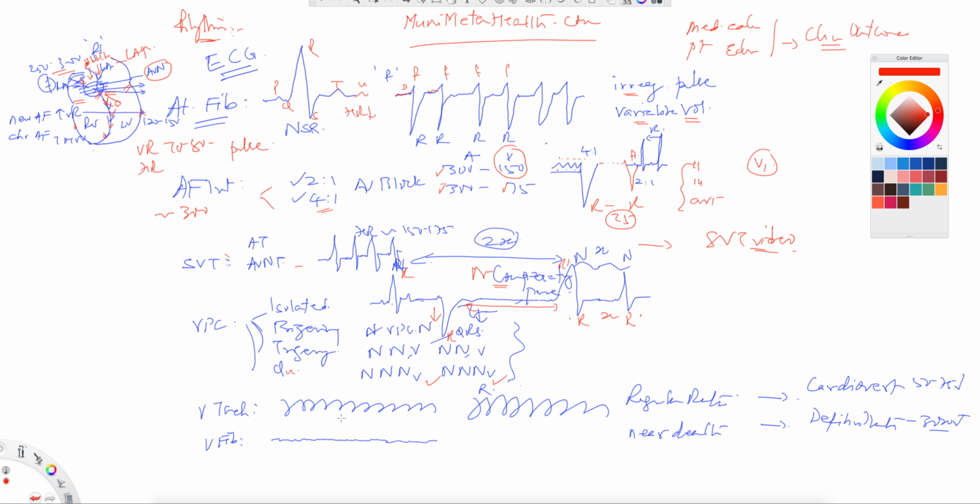Ventricular tachycardia normally is very hemodynamically unstable, obviously, because the rates are about 250 to 300. Here the blood pressure is extremely low, and I think I've dealt with VTACs in a special video, but just so that you know, I'm doing it quickly for the medical students. Here the rate is pretty regular, and the RRs can be mapped and the rates can be checked. But it's a regular rate, obviously, and must be immediately attended to by cardioversion. Normally you give about 50 to 75 joules, and that should suffice, and immediately put this patient back into normal sinus rhythm after you apply the joules here.